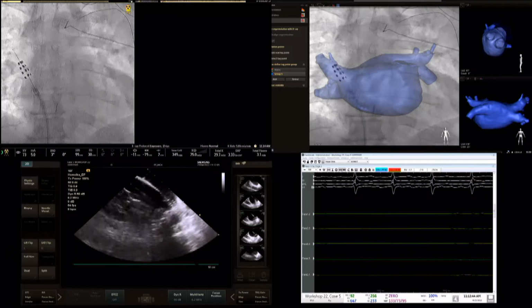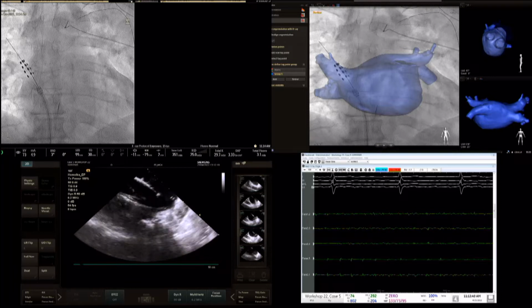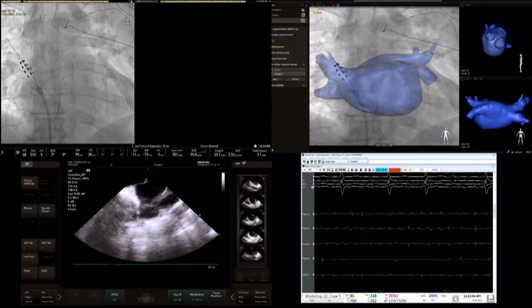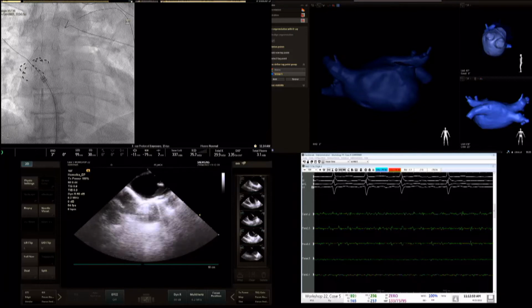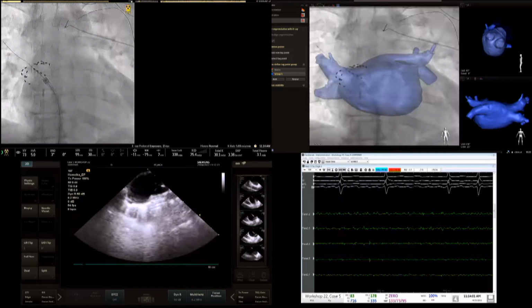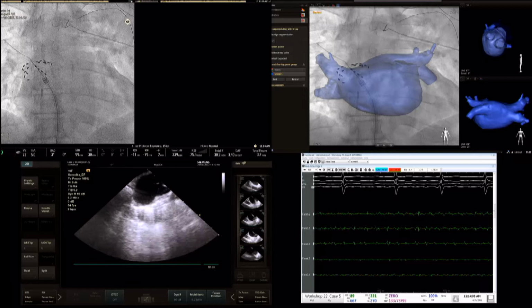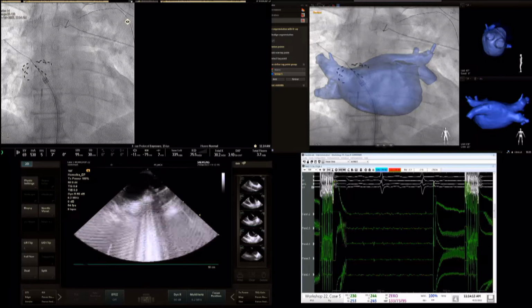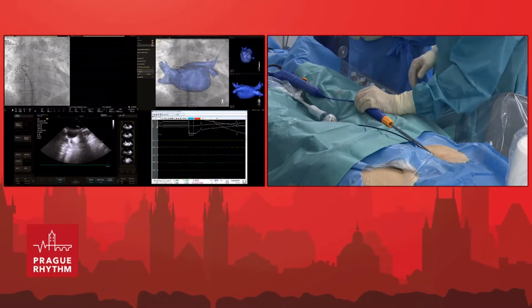Okay, go. Okay, perfect. So we have on the eyes, we have right superior. It's very nice vision. It's perfect. So now I'm going to get again the basket one, and actually on the fluoro, look at the fluoro. We have very nice fitting even on the CT, a little bit like off label, but it's a really good CT integration. Let's go. So we are ready for another applications on the right upper. Go, go, go. Okay, perfect. One more.